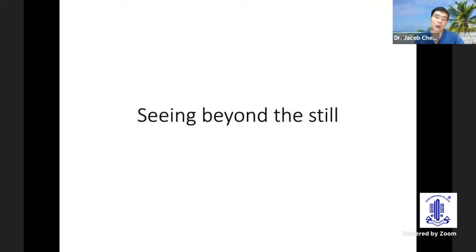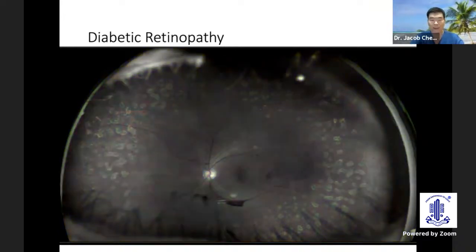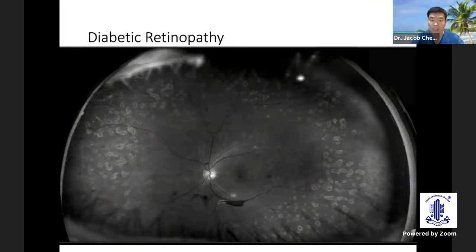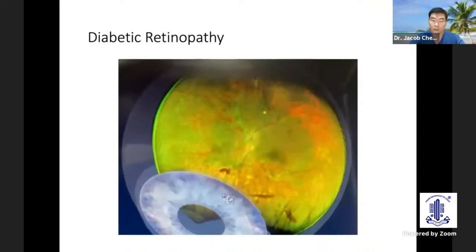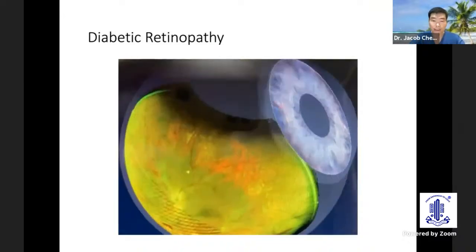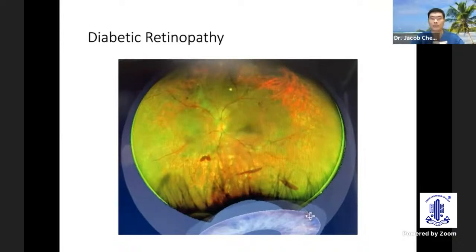How about seeing beyond the still photograph? What is seeing beyond the still? This is another patient, again, with pan-retinal photocoagulation done. Again, probably proliferative in nature, evidenced by the pre-retinal and vitreous remnant hemorrhage. The green channel, green laser, will highlight the retinal pathology well, but sometimes applying the 3D function on my California, you can actually see the areas that are deficient or have been adequately or inadequately lasered, in a sense, with a three-dimension picture.